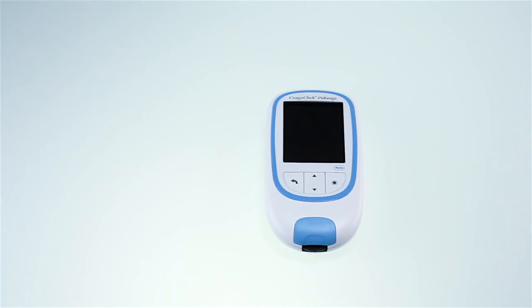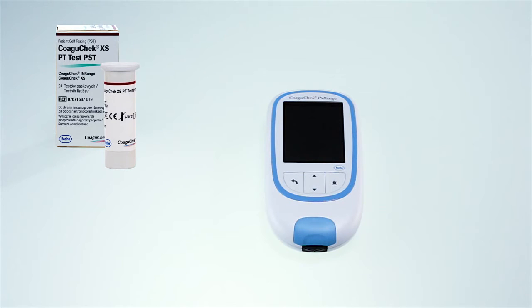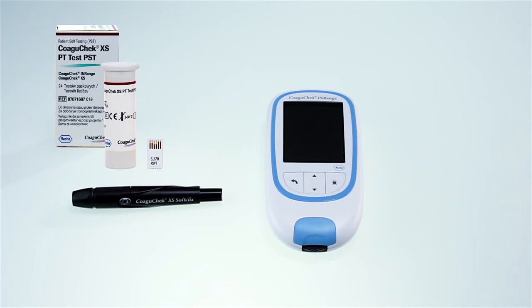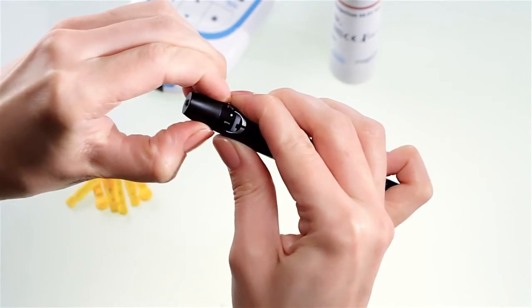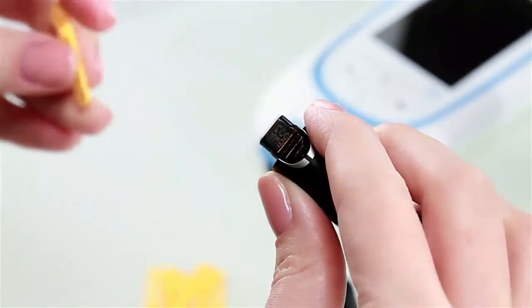The first thing to do is to make sure that you have everything you need to run a test: a COAGUCHECK INRANGE meter, a container of COAGUCHECK XS PT test strips and a code chip, a COAGUCHECK XS SoftClicks lancing device and a COAGUCHECK XS lancet, and a lint-free cloth or paper tissue. Have the test strip container at hand and make sure the code chip belonging to these test strips is available, or that the information has previously been stored in the meter.